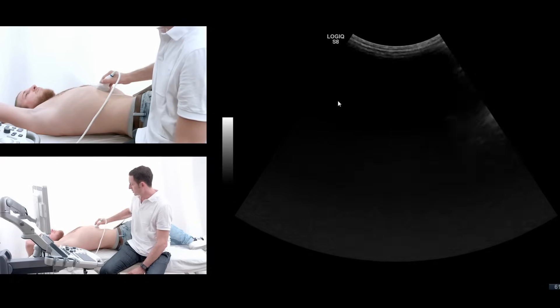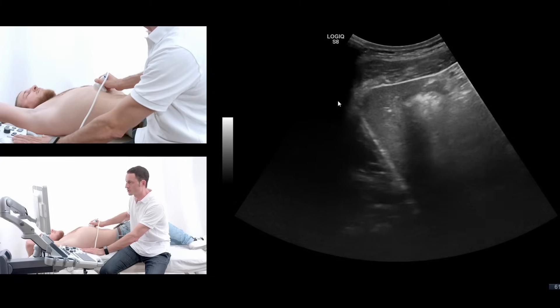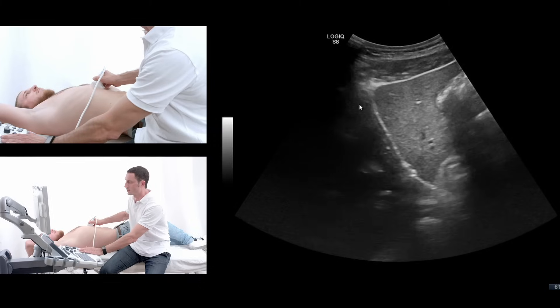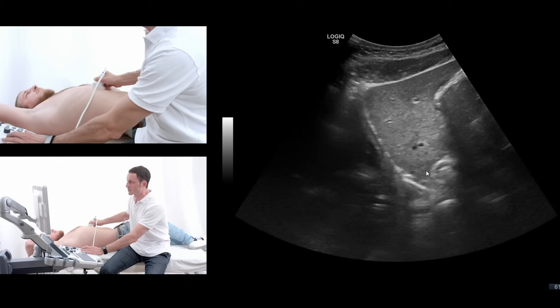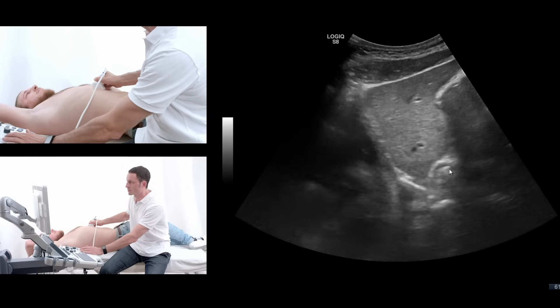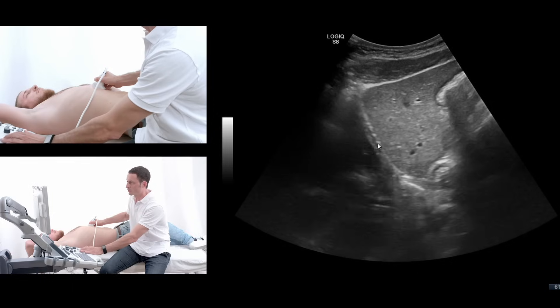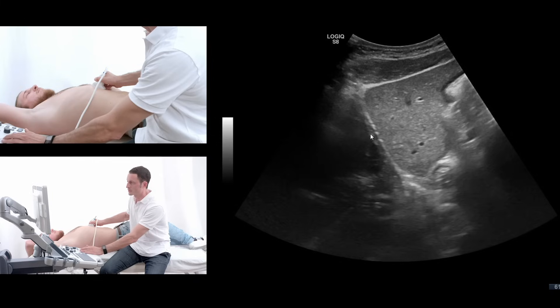When I've done that, I go into a long section through the body to evaluate the left liver lobe in a long section. Take a deep breath again and hold it. You can see the quite filled stomach on the right side of the picture. You can see the entrance into the stomach, and you see the diaphragm as a small echogenic line between the heart and the liver.